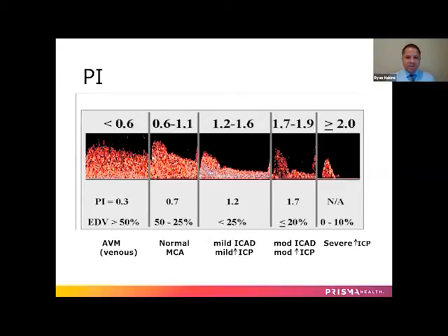See, you have peak systolic velocity, and you have the end diastolic velocity here, and it's perfusing the brain quite well here because the end diastolic velocity, which is represented from this point to this point, is quite high. It's about half of the waveform.